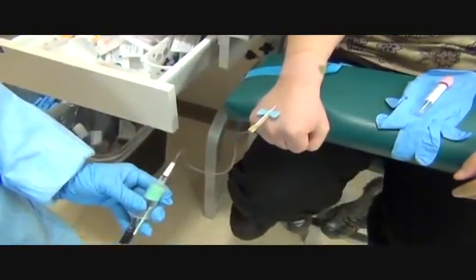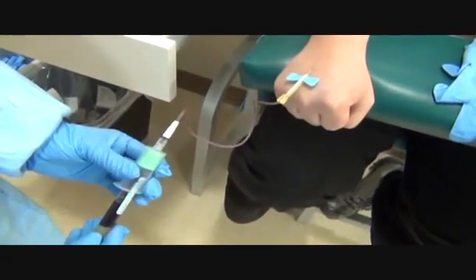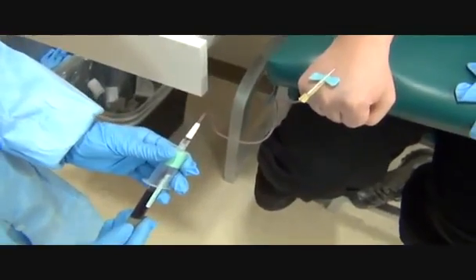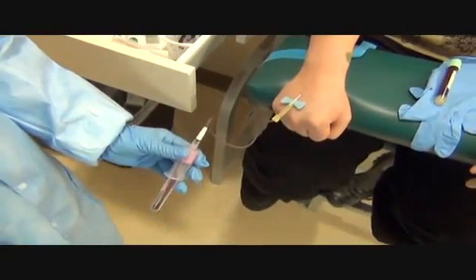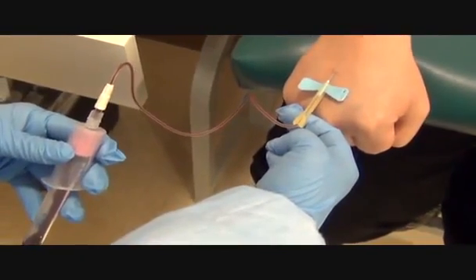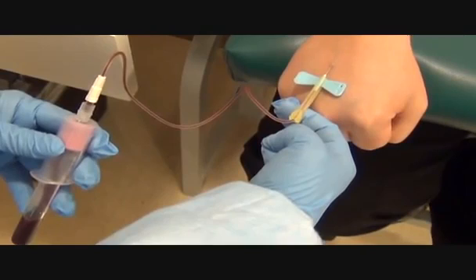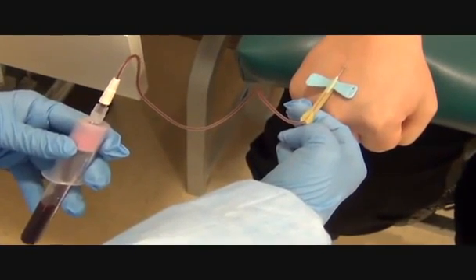Are you feeling okay? Yes. This is a hand vein plus it is a smaller needle so it's going to feel slower — I just have to be patient with it. Because I lost my flow I have to either lift up my angle, which I did and got a better flow because the vein went back to normal size once I popped the tourniquet. Or another way I could have done it is to anchor on the skin a little more so it would have come back to the surface and I could have got the flow better.